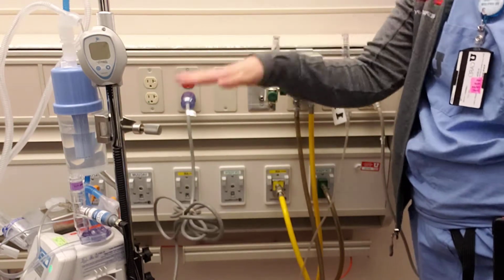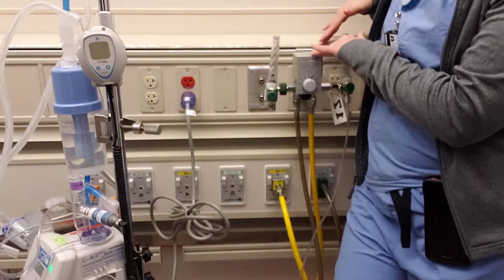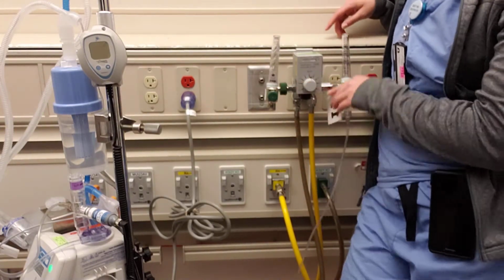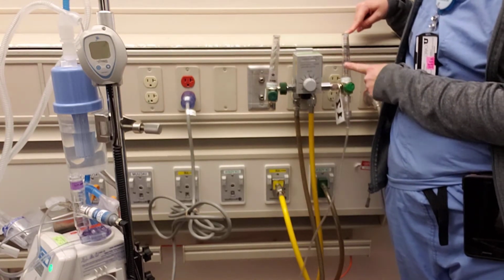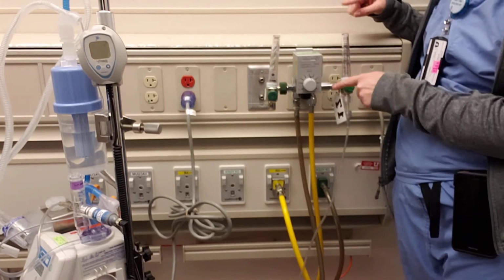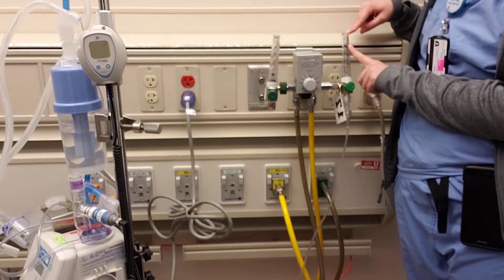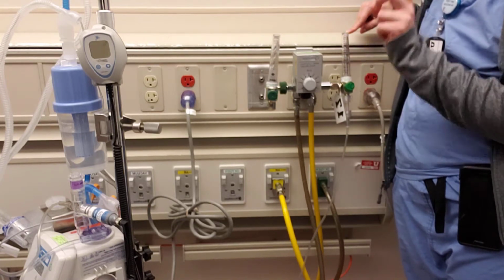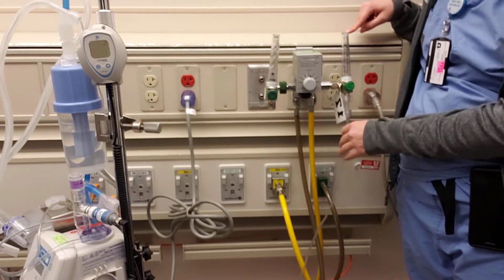We have our blender here that we can adjust the FiO2 to. And you need a 15-liter flow meter attached to the blender, because we run bubble CPAP on 12 to 14 liters of flow. That is a big deal. 12 to 14 liters of flow is what is used for bubble CPAP.